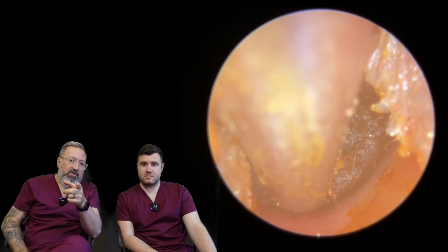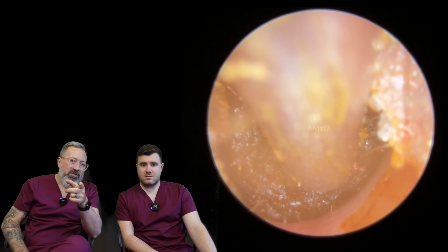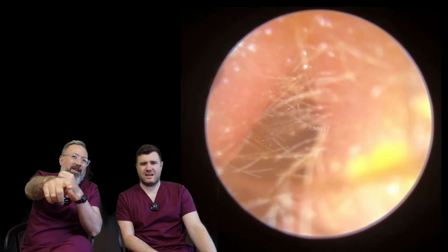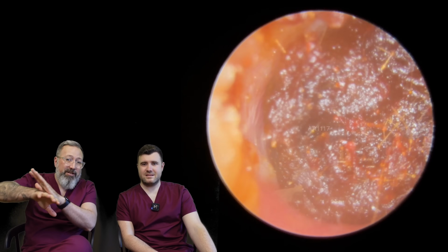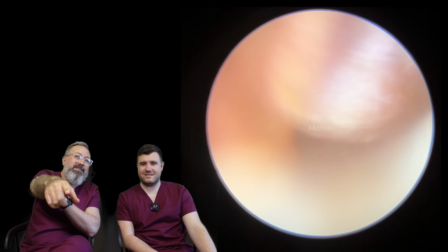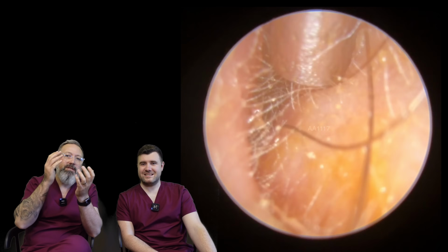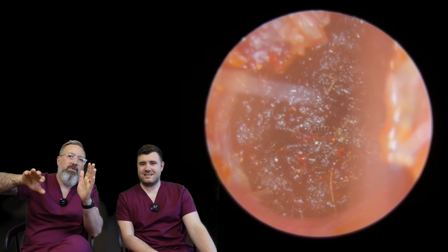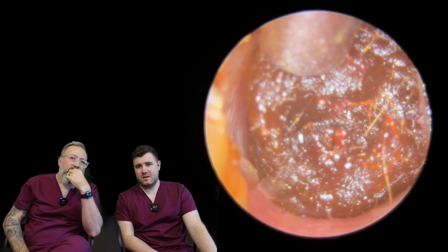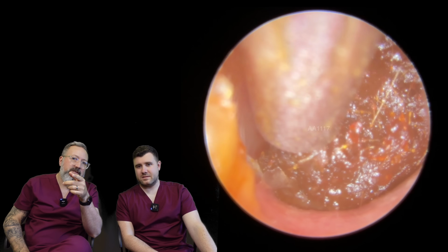But you can see on this one, we're just lifting from the edges here, just trying to get that plug to move forwards. Look how narrow that is. Really narrow. So we are literally holding the side of the... This is what I mean about the olive oil. Do you see what happened? I put some in just to try and soften things up, but you can see, because I've got to hold that canal open on the one side, as soon as you put it in, that oil just blurs the camera. That's a nice view there, in fairness.